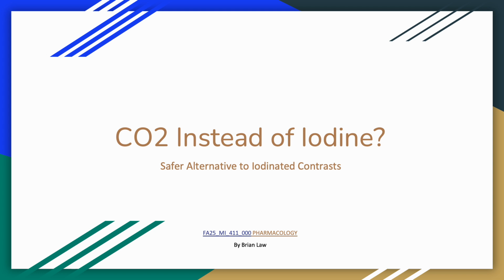So when physicians need to look at blood vessels using x-rays or CAT scans, they typically inject a special dye called iodinated contrast media to make the vessels show up clearly on images. However, some patients can't safely receive the iodine-based contrast because it might damage their kidneys or cause allergic reactions. For these high-risk patients, carbon dioxide gas offers an alternative option. This is a summary examining the safety and effectiveness of using carbon dioxide as a contrast agent in vascular procedures.